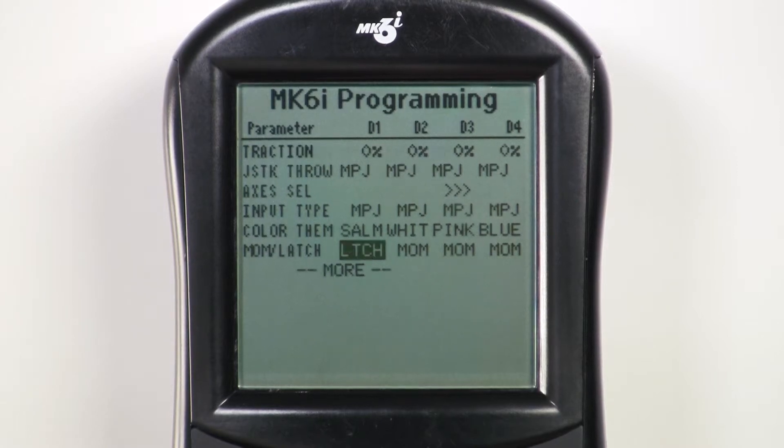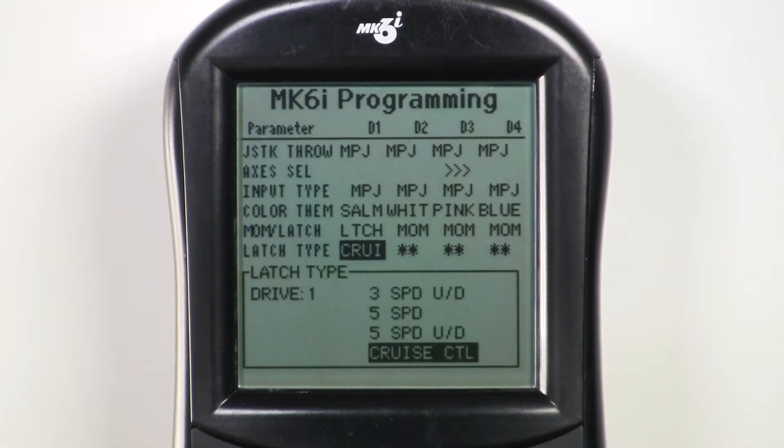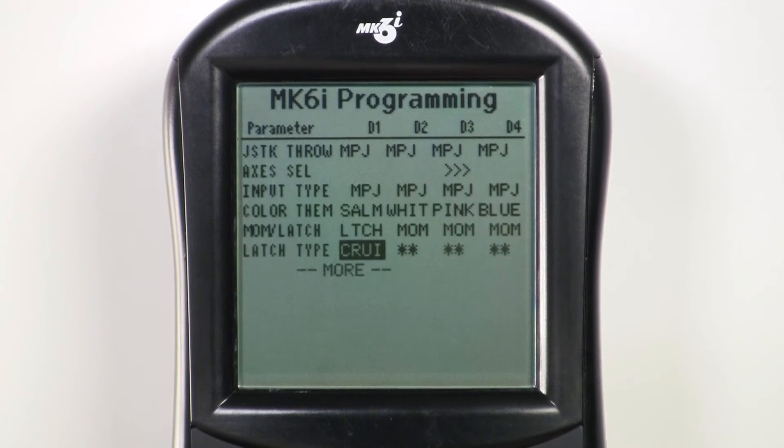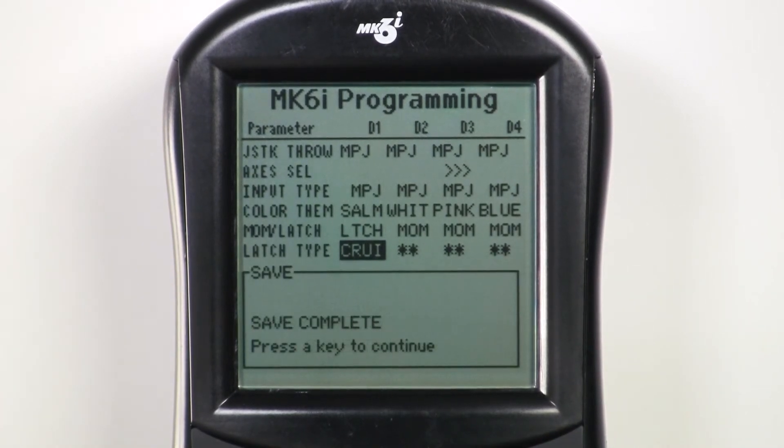Now scroll down one more spot and you'll see latched type has appeared on the programmer. Press select again and you can choose one of several latched types in the system. In this case we'll keep it on the default cruise control. Press select, then press save, and press save again. Pat yourself on the back — you've done it.